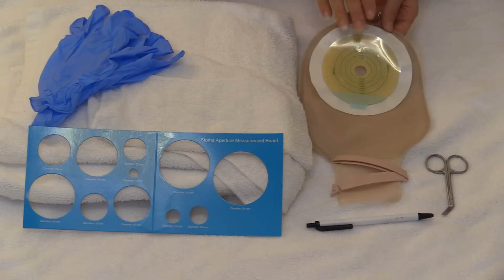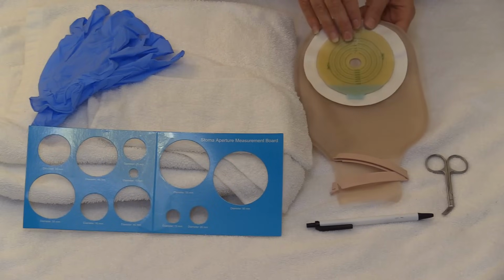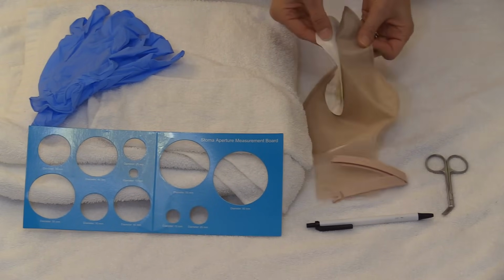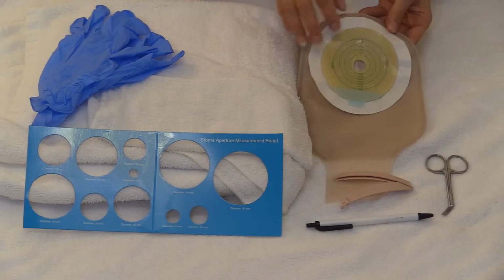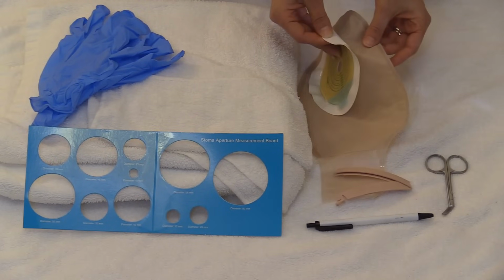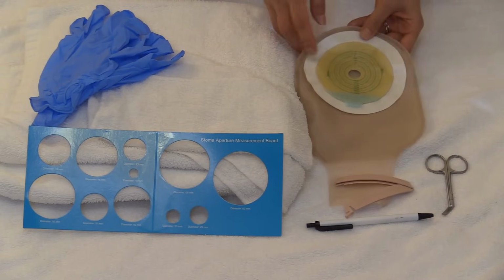You will need a pouching system. Here I have a one-piece pouching system, and it has a skin barrier, also called a wafer or flange, and it's attached to the pouch, so it comes together. Some people have the two-piece systems, where the skin barrier and the pouch are separate and they snap onto each other whenever you're placing the system.